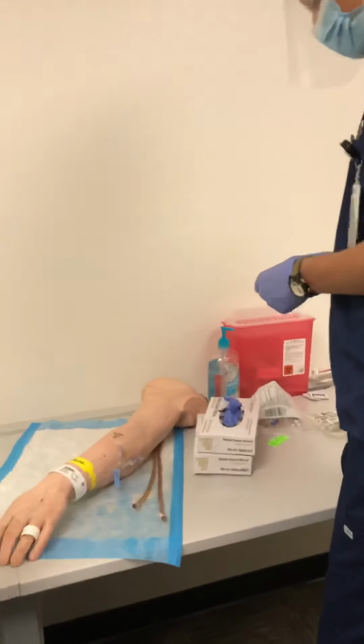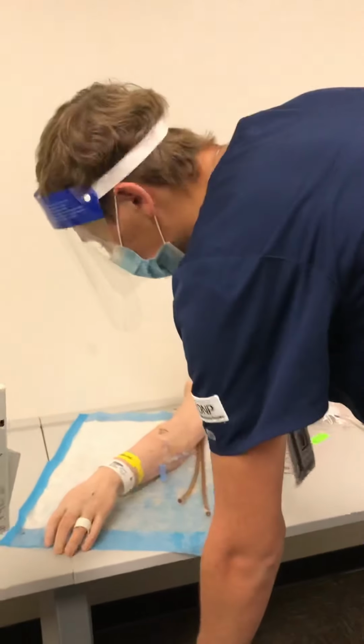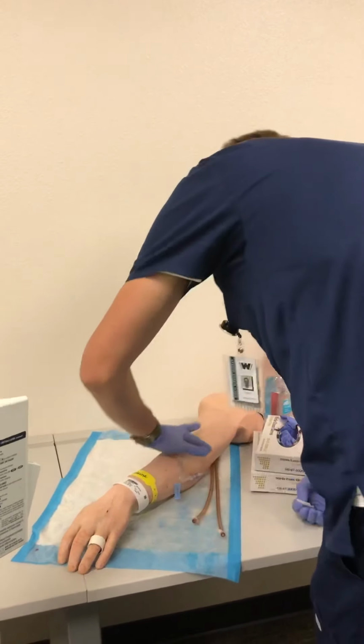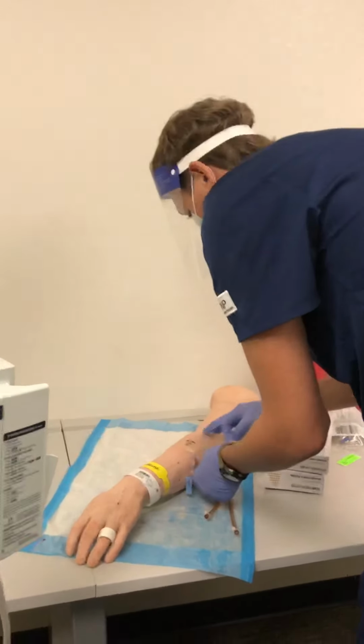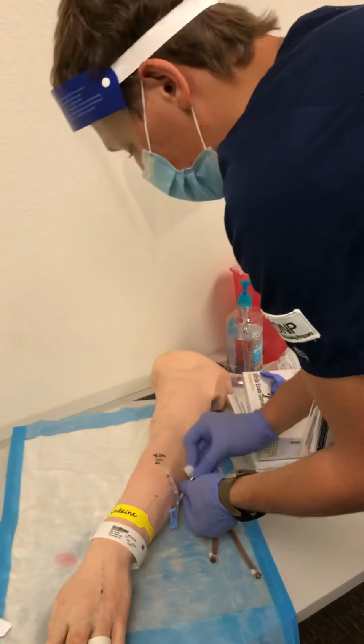So before I do anything, I'm going to make sure that the client's saline lock is unlocked here. I'm going to look for any signs of infiltration in the site here, make sure that there's no pain or redness or anything like that, and then I'm going ahead and clean the site.